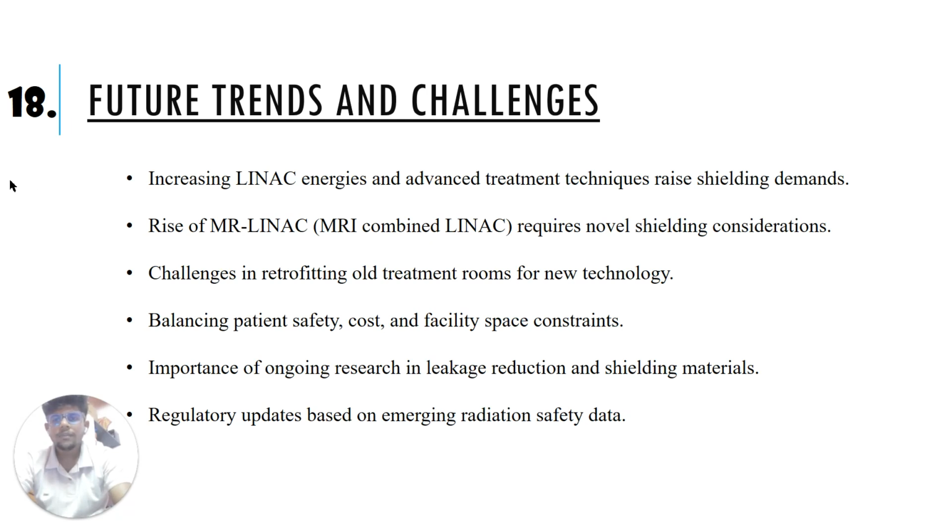Future trends and challenges. Increasing LINAC energies and advanced treatment techniques raise shielding demands. The rise of the MR-LINAC, the MRI combined LINAC, requires novel shielding considerations. Challenges in retrofitting old treatment rooms for the new technology. Balancing patient safety, cost, and the facility space constraints. Importance of ongoing research in leakage reduction and shielding materials. Regulatory updates.